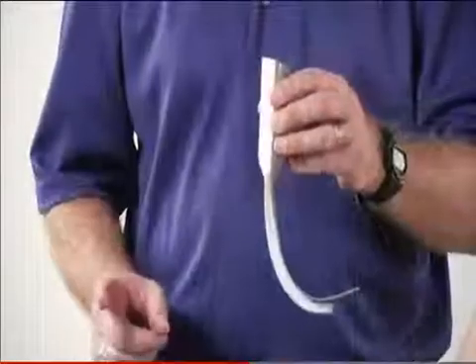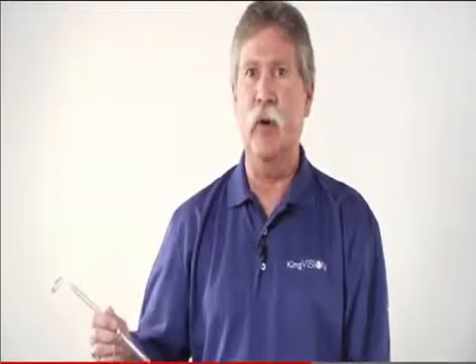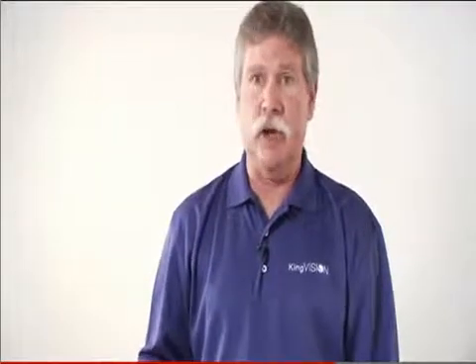With a standard blade, obviously it does require the use of a stylet, and this requires a little more preparation ahead of time to lubricate the stylet and form it and all that. But you do have the versatility of the smaller mouth opening requirement. What we've found, though, is that the indirect tube delivery method associated with the non-channeled version is technically a little bit more challenging. But if you've already mastered this technique, and all of your colleagues that might be using this device have also mastered this technique, this is probably the slightly more versatile blade to be used.